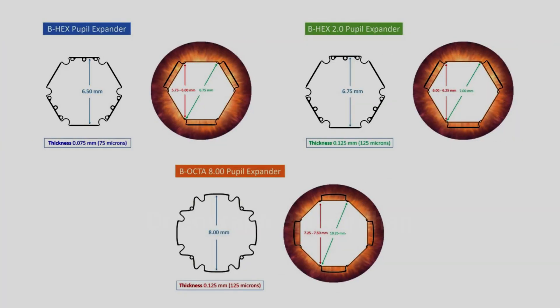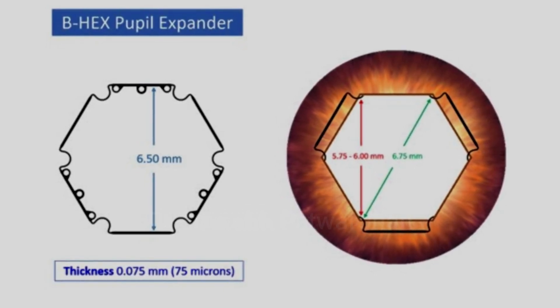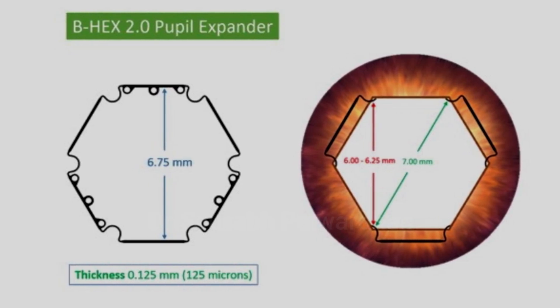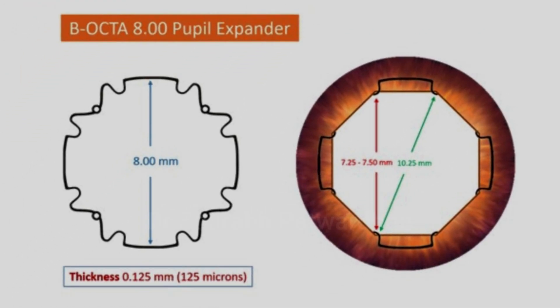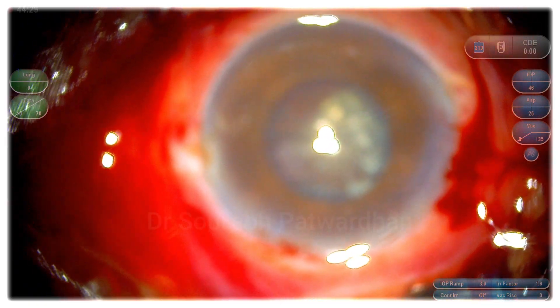Now I am thinking of which pupil expander I should use. B-Hex has already been there — Dr. Suven Bhattachary has devised it and it's amazing. But now we have B-Hex 2.0 also: it is larger, diameter 6.75, thicker at around 125 micron. And now we have another one by Dr. Suven — the B-Octa 8mm. Its length is 8mm, thickness is 125 micron, and if you check the diameter it can be almost 10mm. So I thought I should use it — I am using this for the first time in this case; I just got a few samples from him.